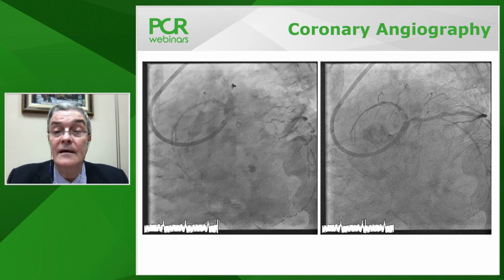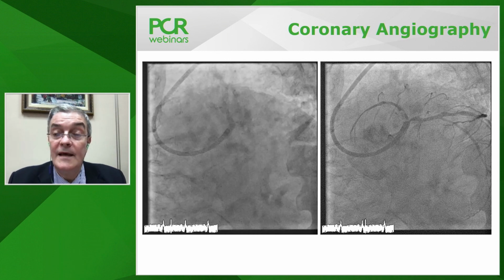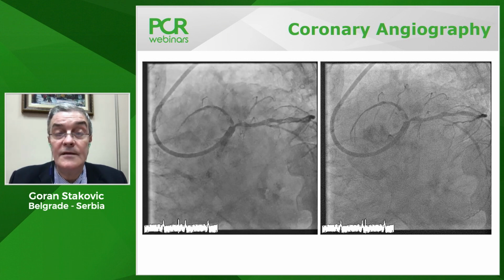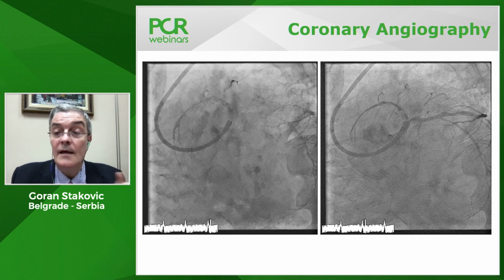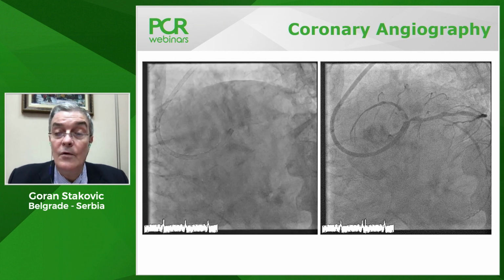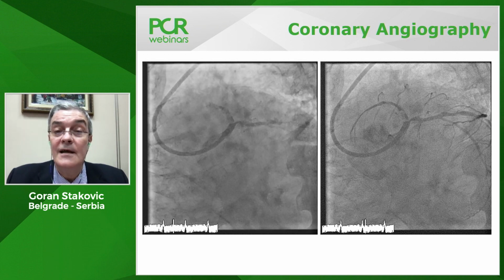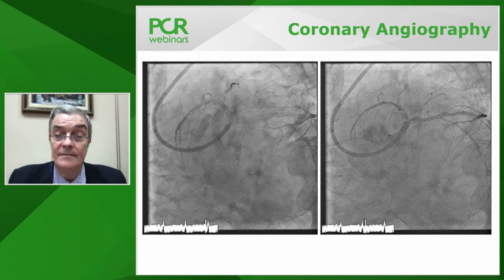So let's see. I think this is very important. We all agree that both cases are angiographically very complex. Most probably in both cases, we start thinking of a two-stent strategy from the beginning, and there is just some small individual difference in strategies, but at the end, we all aim for achieving an optimal procedural result. So, Prof. Tan, you said DK crush. Please lead us through the steps of double kissing crush in 2020.